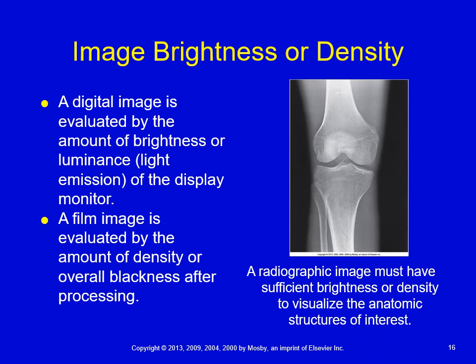With digital, mAs is less of a controlling factor because we have all of the internal applications and controls that we can use to change, per se, how the image looks. We can make it lighter or darker post-processing, whereas with film screen, what you see is what you get. So mAs really played an important role. If the mAs was too high, your image could potentially be too dark. If your mAs was too low, your image could potentially be too light.